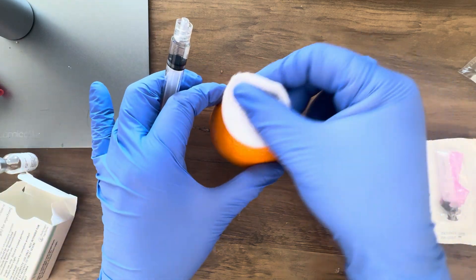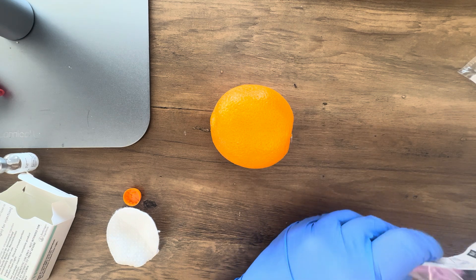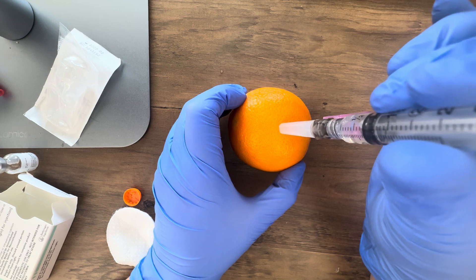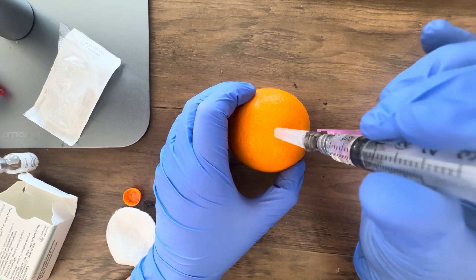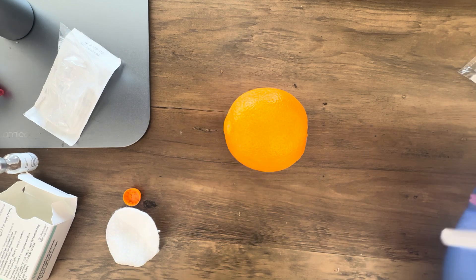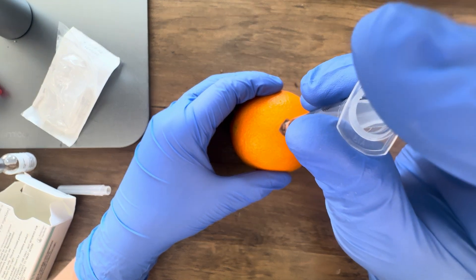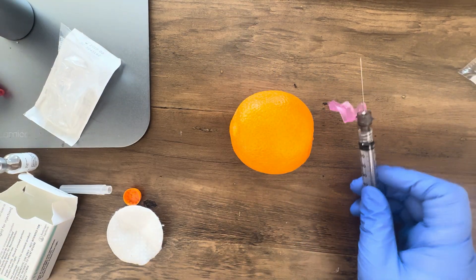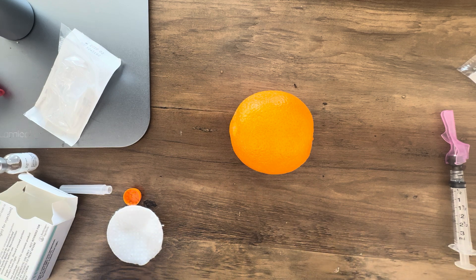We want to clean that area with our alcohol prep pad, then put on our IM injection needle to give the medication. When giving this medication, go in at a 90 degree angle straight into the muscle — for the deltoid I go in about three quarters to an inch deep. Once injected into the muscle, push down the plunger to inject the medication. These needles have a safety mechanism where we can lock the sharps. You don't need to massage the muscle — just watch for the patient to improve in about one to two minutes as the medication takes effect.